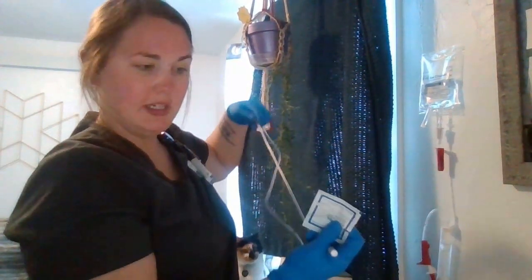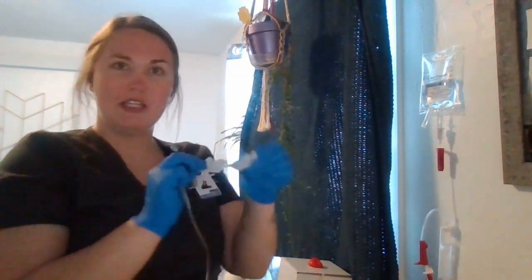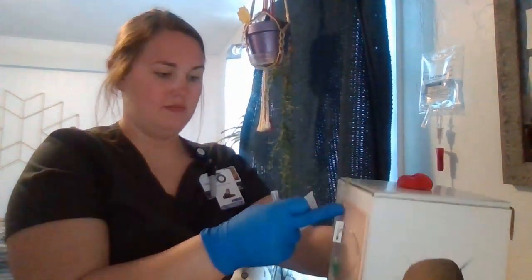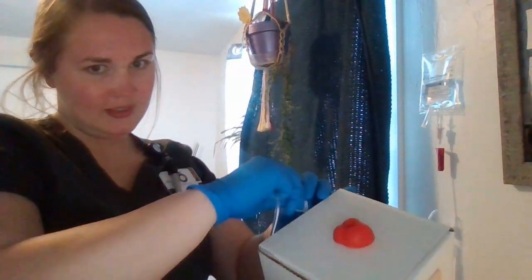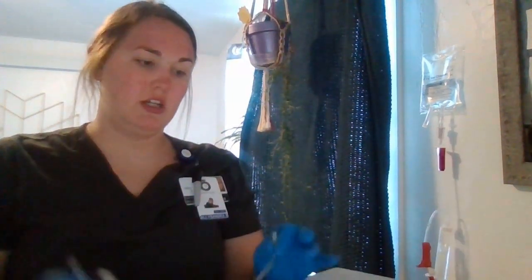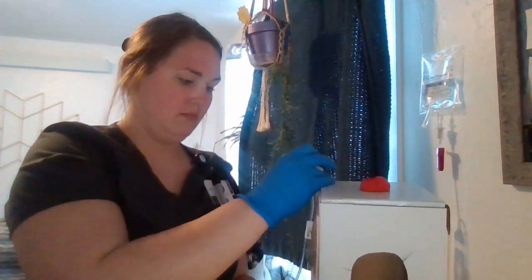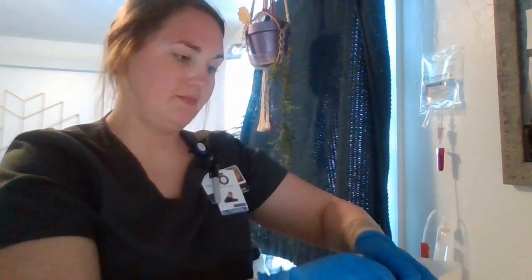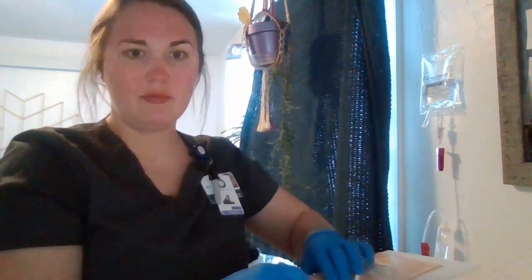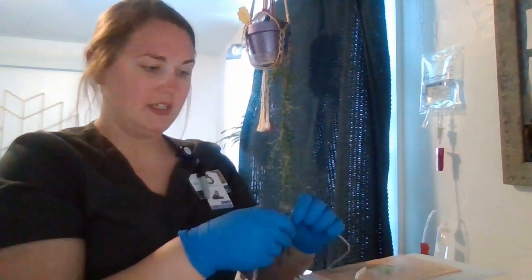Once I've done that and my tubing is primed, I can then connect it to the patient. I'm going to take my alcohol wipe and I'm going to clean my patient's IV site here. I'm going to make sure that there's no other infusions running on this patient. I've made sure the J-loop is clean here and then I can connect it to my patient and take the cap off.